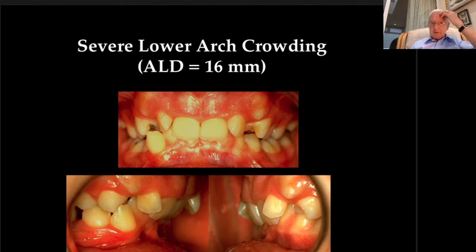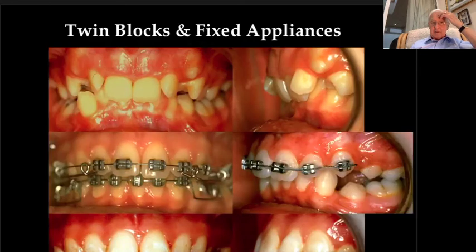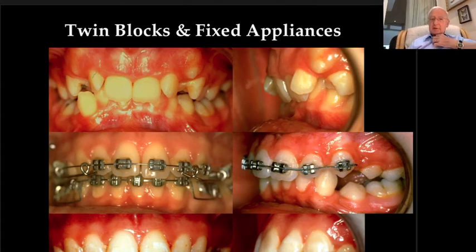to extraction therapy, and I could not obtain permission to treat this patient without extractions. Therefore, the only question was, which teeth to extract? The lower right canine was distally inclined and blocked out of the arch. I decided to extract the lower lateral incisor to allow the canine to upright and be accommodated in the arch. In the other 3 quadrants, first premolars were selected for extraction.